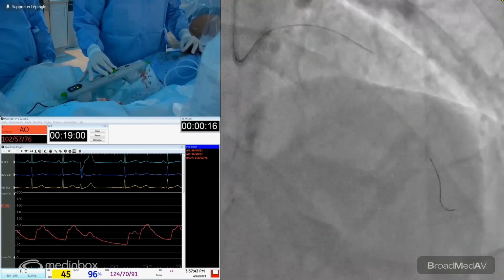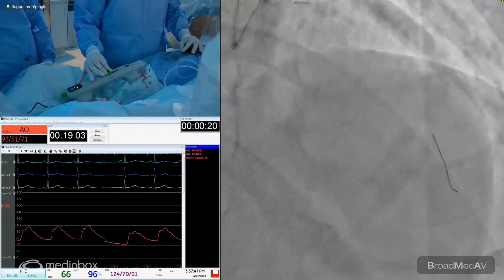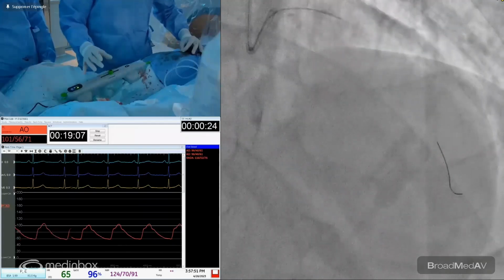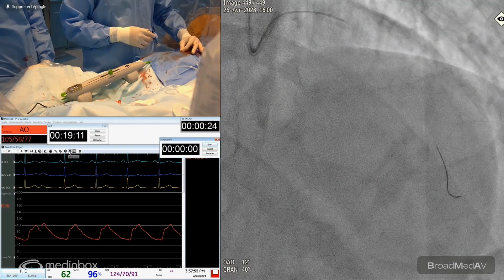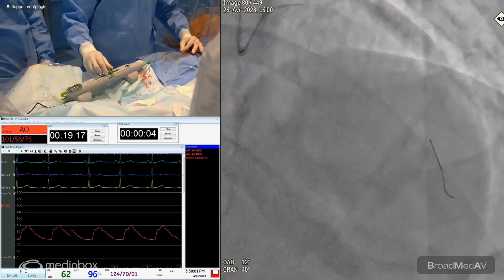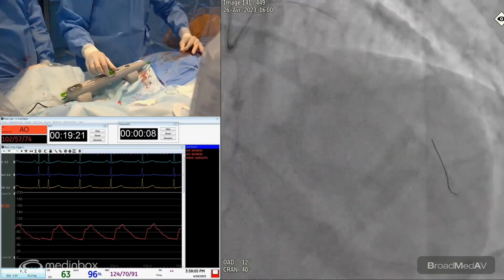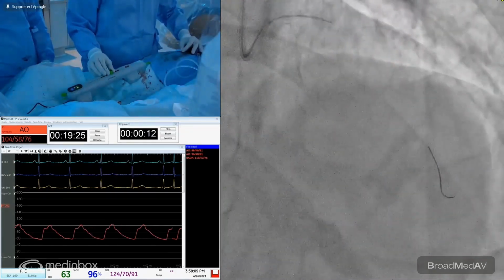Here we have some resistance, extrasystoles. When you hear the beep, that's when you should stop. There you go. When you stop, you let it breathe. Make sure you don't get no reflow. And then after 10 seconds or so, you can restart again. I want to make sure to get that bend, to have good expansion afterwards. Here we go.